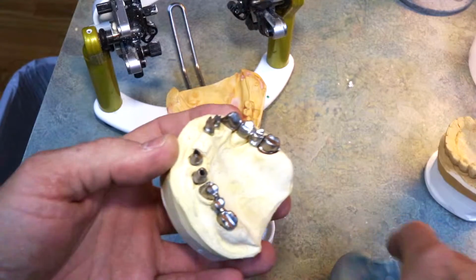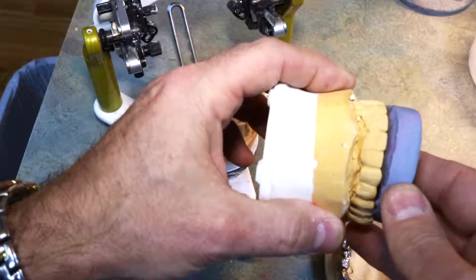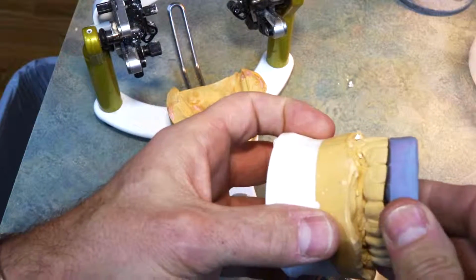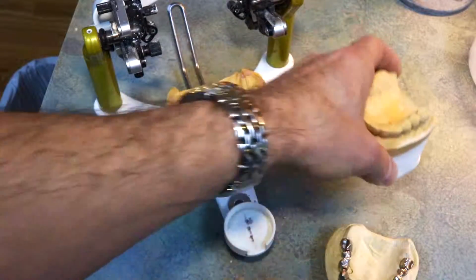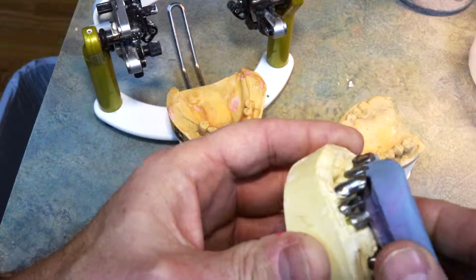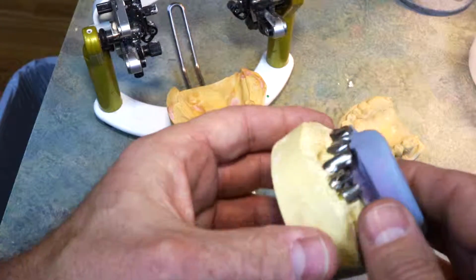this point. This was all manufactured using an index from the cast of the provisionals. Because it's a maxilla, we have the good fortune of being able to index off the palate. So this palate, and we have a nice impression of this palate, so we can index everything together, and that enables for us to build this framework within the parameters of the provisionals.